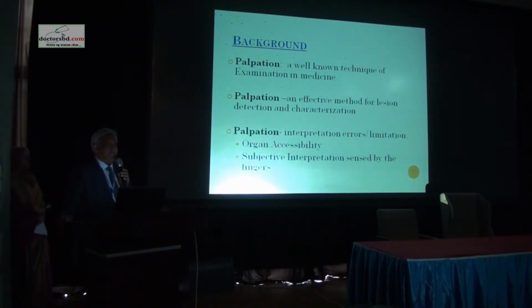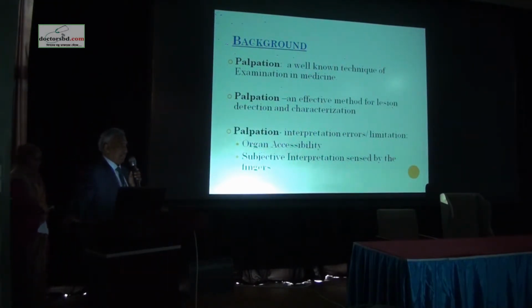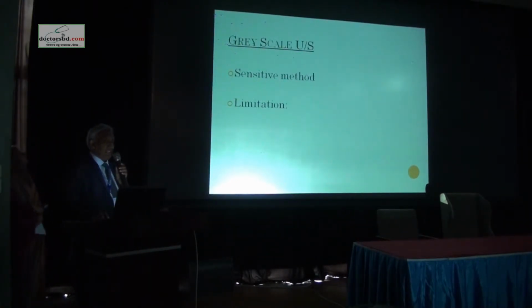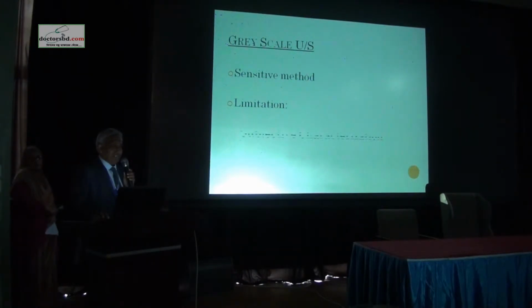At times you don't have good organ accessibility. You find difficulty in accessing the organ. And there are sometimes controversies between different examiners. A lesion is cystic, some would say it is solid, some would say no, it's hard. So amid those controversies, gray scale ultrasound was found to be an option, and the method is very sensitive, devoid of all those limitations felt by the fingers.